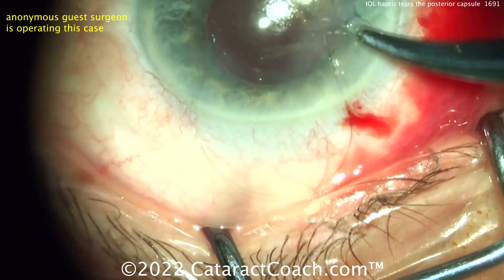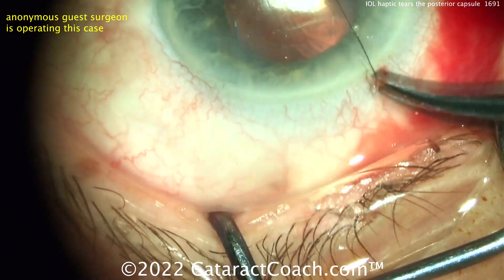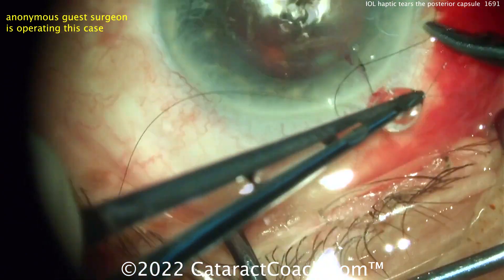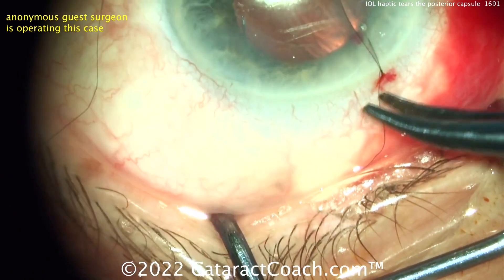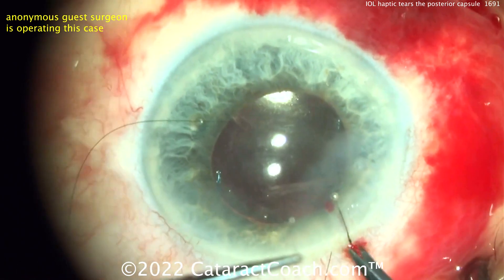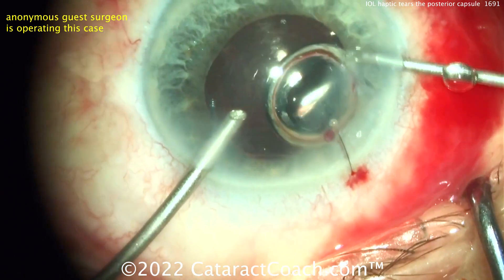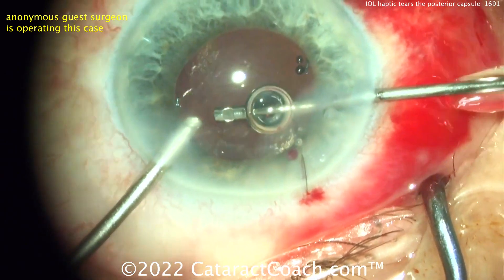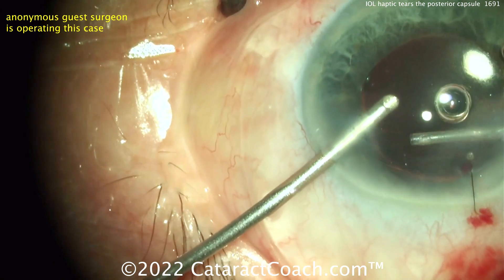There is going to be some vitreous prolapse that needs to be cleaned up, and that can be done with a bimanual approach — 23-gauge instruments would be great through two paracentesis incisions. The vitrector is going inside the eye, cleaning up anything remaining. Triamcinolone would help a lot here to confirm there's no vitreous prolapse.